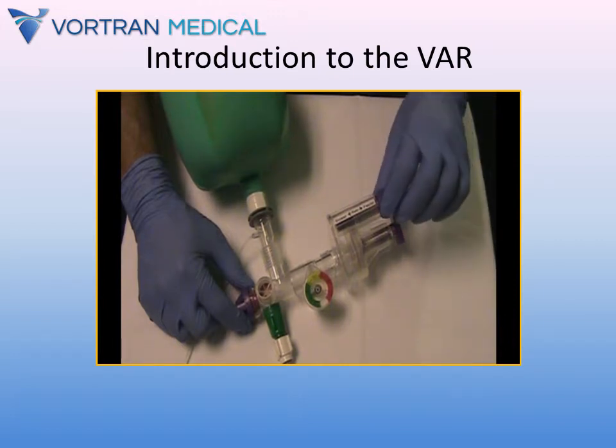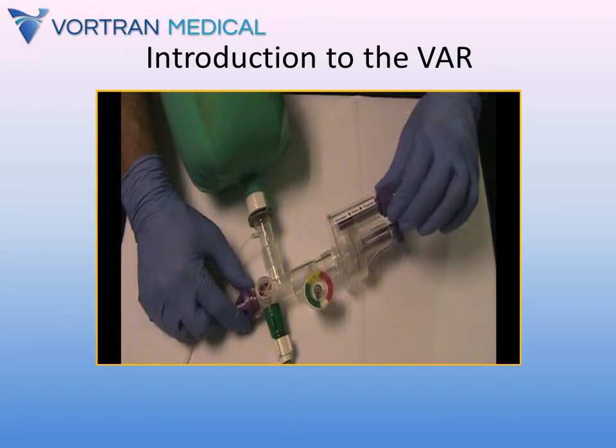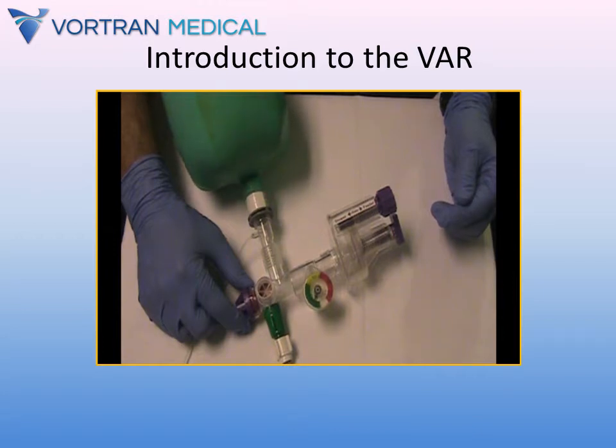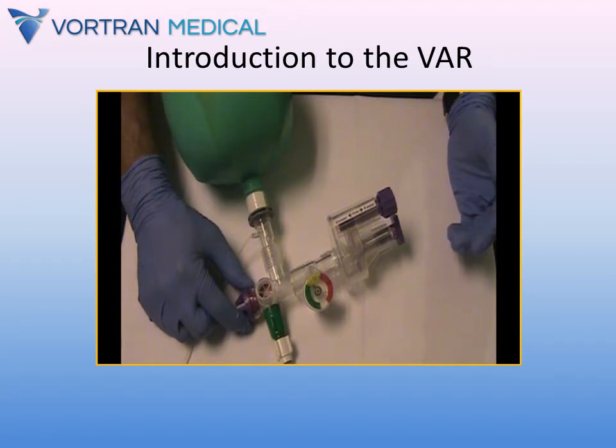And now we back the respiratory knob out just until respiration starts. And that leaves us with about 10 to 12 breaths a minute, which is right in line with what the AHA recommends for an intubated patient.